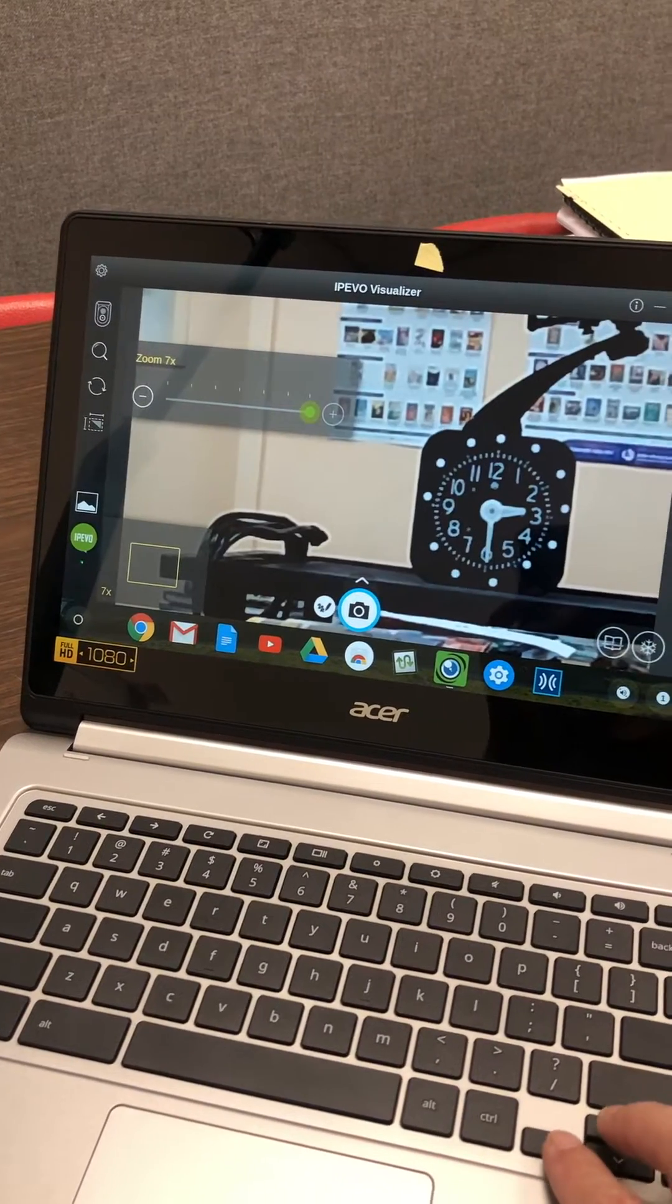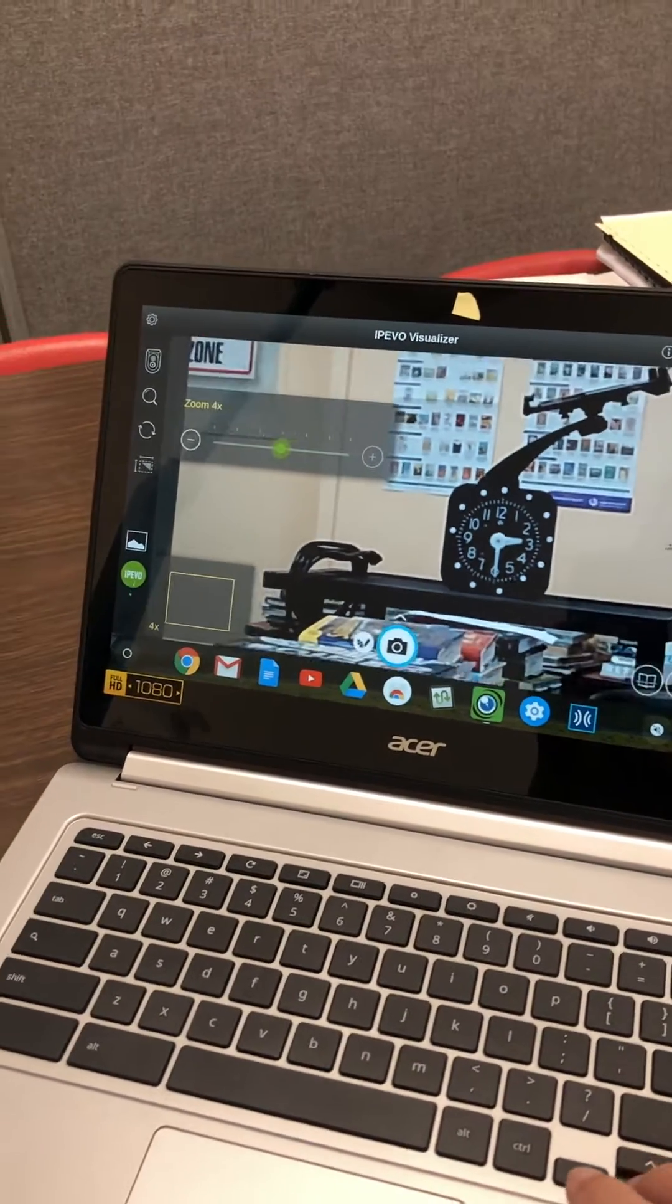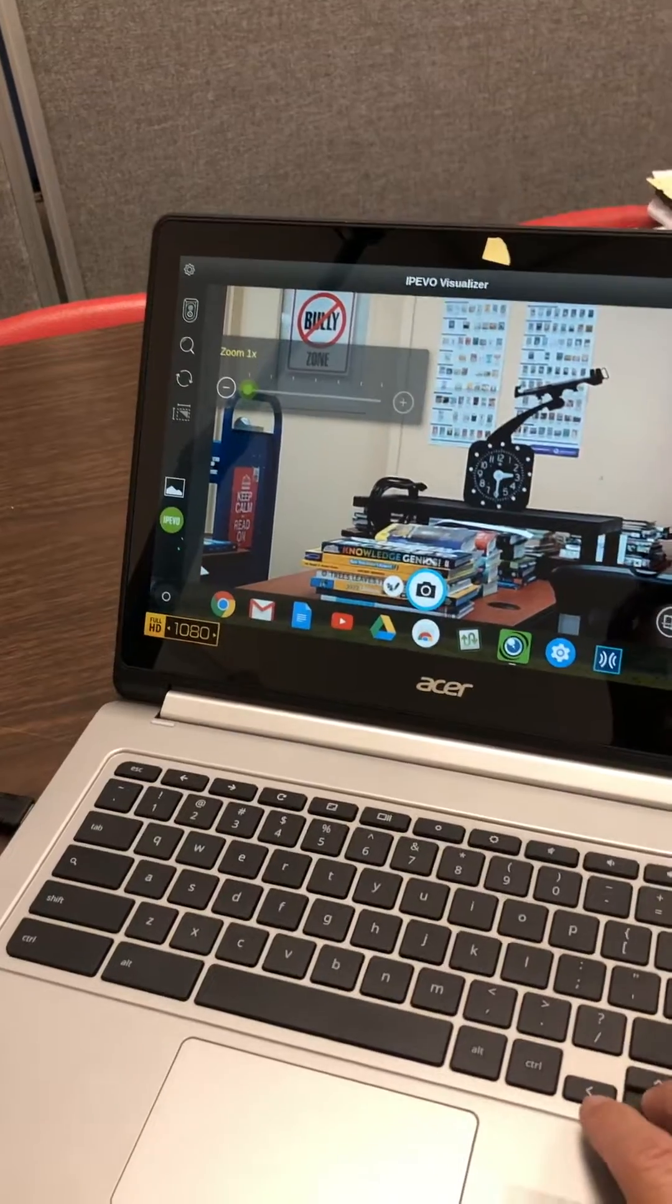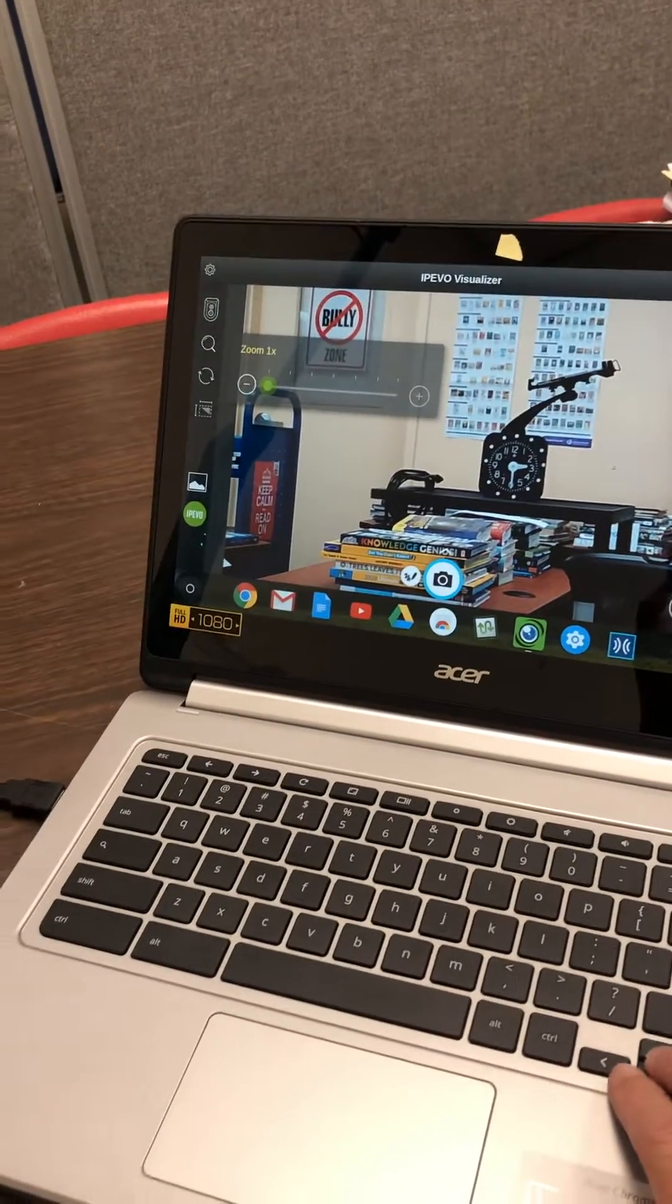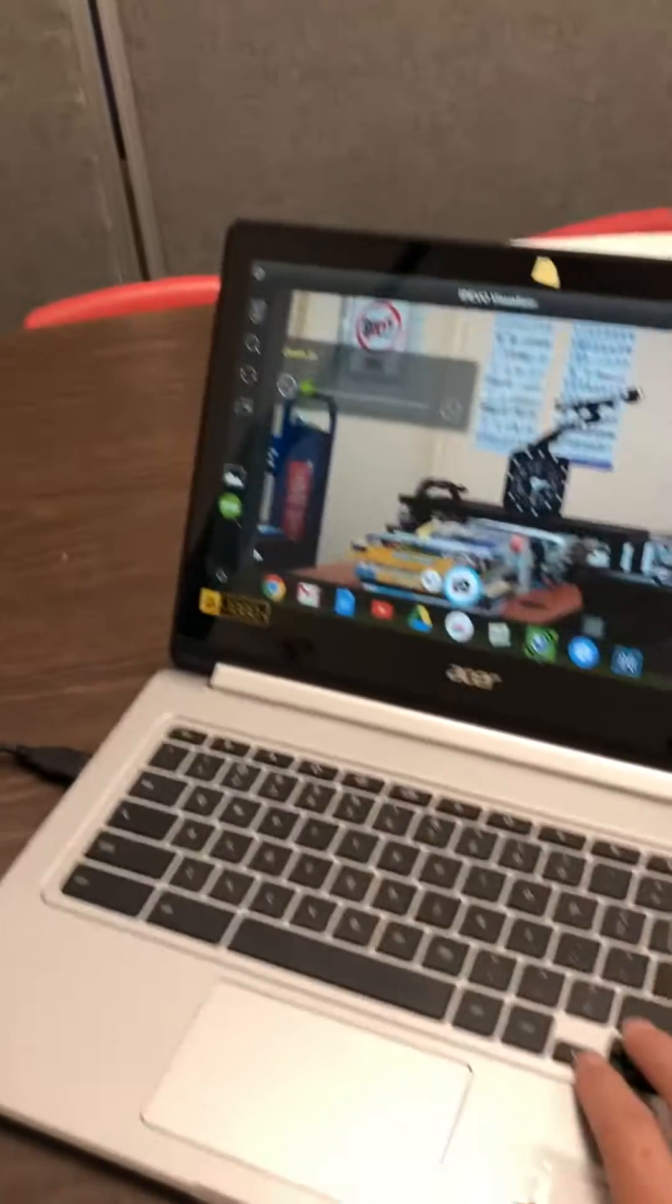And then there's lots of other features with this camera. That's how to hook it up. And the distance and resolution you're getting looks pretty good.